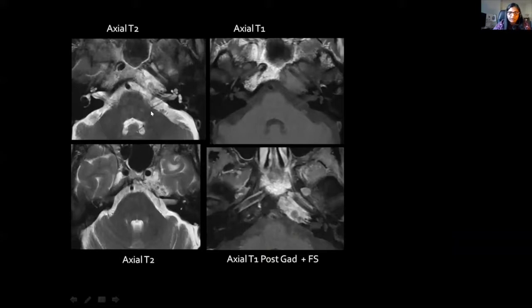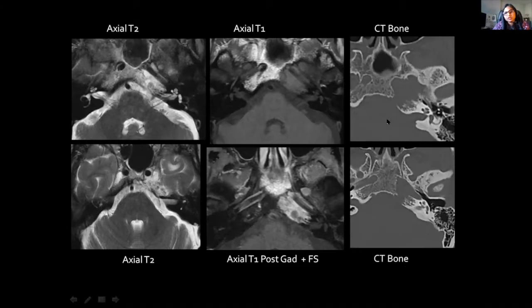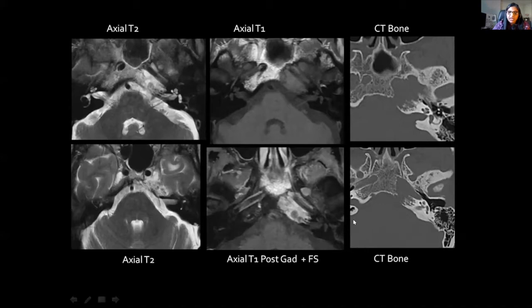The first example is a lesion centred on the left petro-clival synchondrosis. It shows relatively high T2 signal intensity, and on T1 it is isointense to the brain stem — note the beauty of fat delineating the tumour margins. Post-contrast fat-suppressed images show fairly avid enhancement with a little heterogeneity. High-resolution CT demonstrates the destructive nature of the tumour, eloquently showing its location at the petro-clival synchondrosis with erosion of the petrous carotid canal and petrous face. This is a chondrosarcoma.